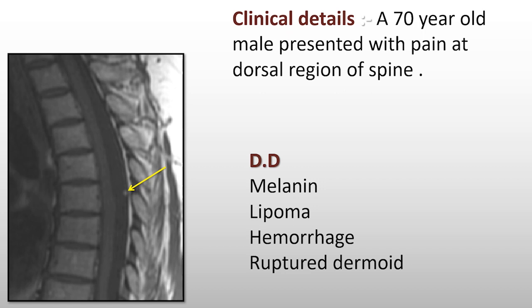Another possibility is a ruptured dermoid cyst with dissemination of fat droplets into the subarachnoid space, which can present in a similar manner. To differentiate these, we can perform a fat-saturated sequence: lipoma and dermoid cyst should show signal suppression. If it is not suppressed, it is more likely protein, melanin, or hemorrhage — protein can also appear T1 bright. A fat-saturated sequence was performed, and the lesion is not suppressed.